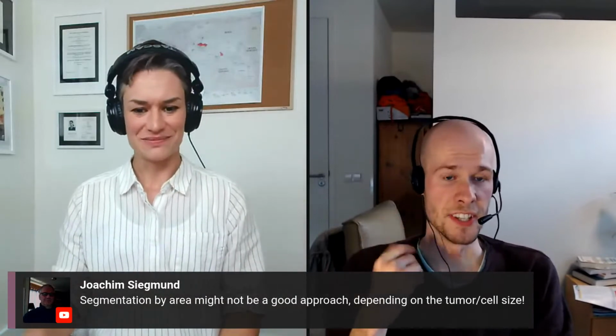So this is indeed kind of a philosophical discussion. It honestly is, because you have to wonder, okay, in what way am I phrasing this clinical metric that I'm determining via histopathology? How will I accurately represent this very abstract total PD-L1 activity? I can either do cell counting, but at the same time we acknowledge the fact that no reasonable pathologist in clinical practice will count 100,000 cells in a resection. Even 10,000 cells in a biopsy is quite a bit of work.